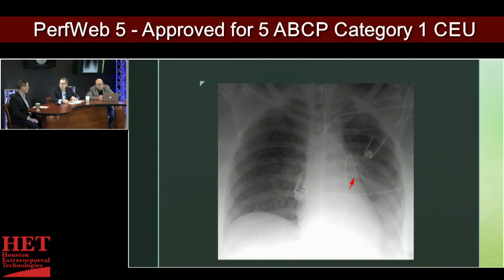Does that matter clinically? I mean, the pressure would be the same, right? No, the pressure should be the same unless they have some anatomy on the left side. If they have a pulmonary embolus on the left side, you obviously shouldn't be putting pulmonary catheters in those patients. But if they have a large effusion on one side and their mediastinum has not been open or their pleura has not been open, they could have some slightly elevated pressures. But I think it would be very subtle and it would be difficult to pick up, and you wouldn't really have any way of knowing unless you have simultaneous measurements of the other side.